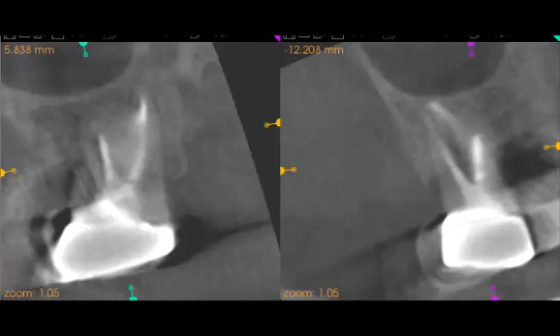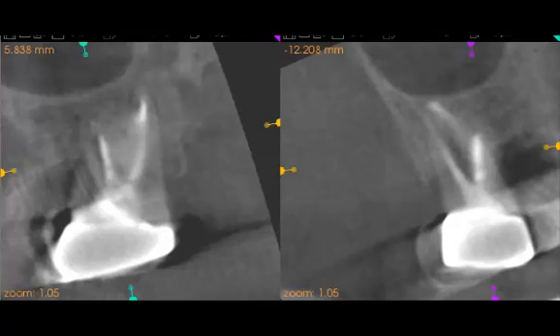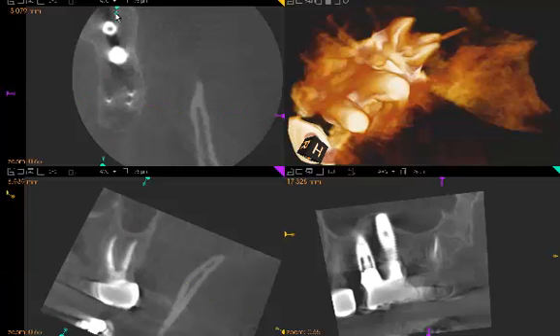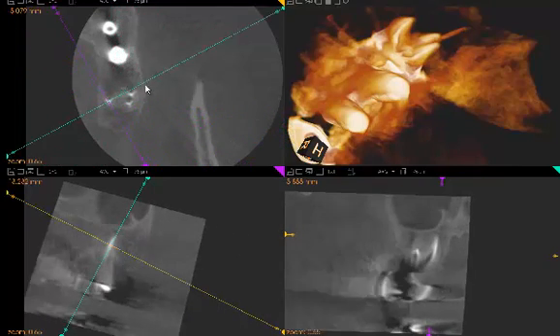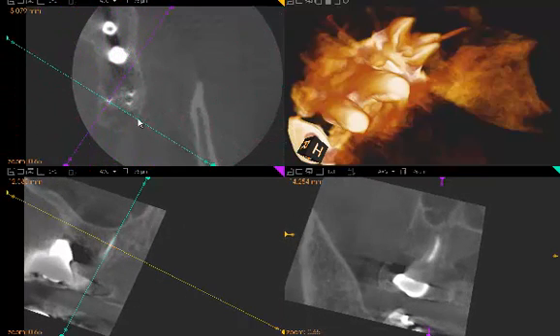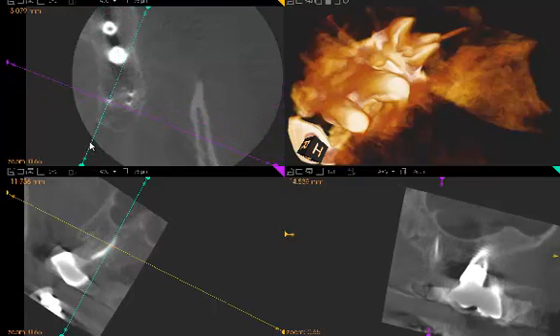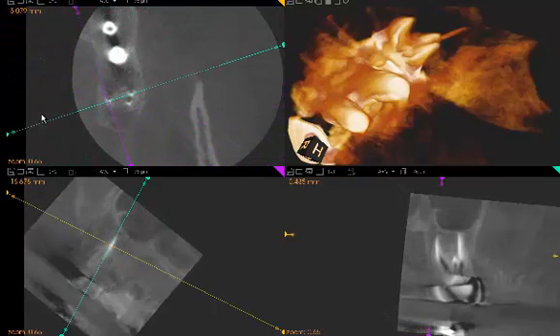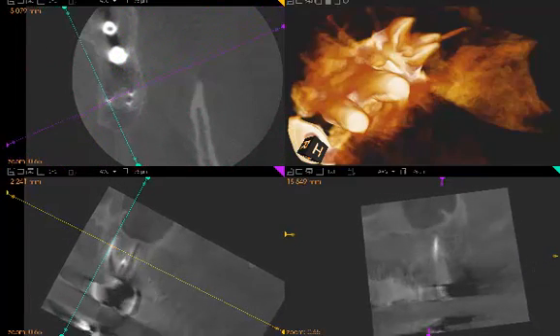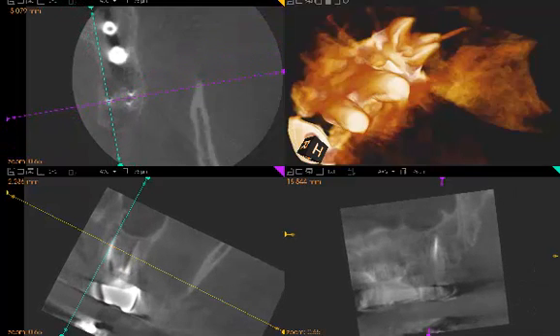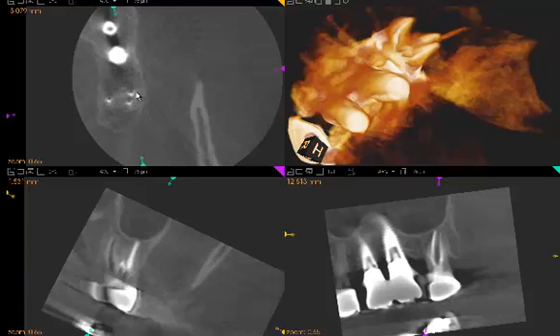The first thing I do when examining a cone beam CT long-term recall is I use the oblique window in the software. I like to line up the axes right along the long axis of each canal in the apical third, and then rotate it like a top in the transverse plane. Starting with the palatal root, as I rotate around it, that root looks very good. Maybe there's slight PDL space widening apically, but there is no radiolucency, the sinus cavity looks clear, and it looks like that root is healed.